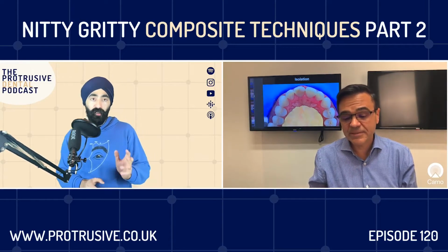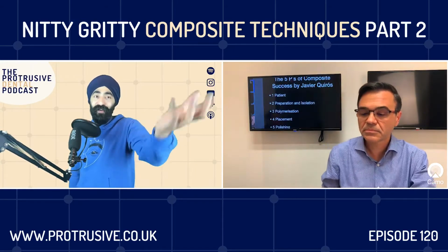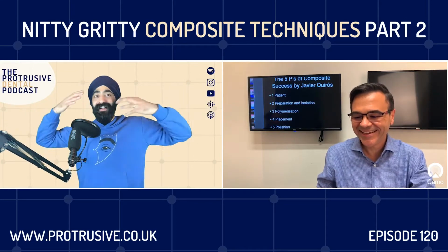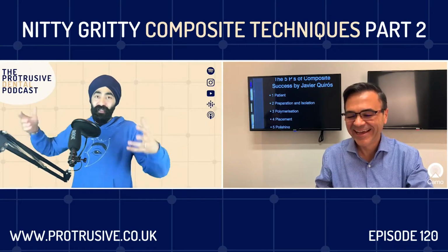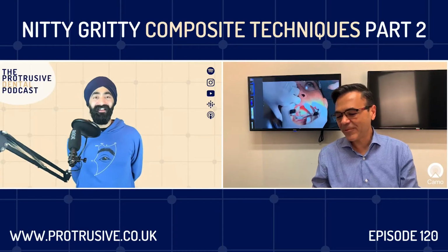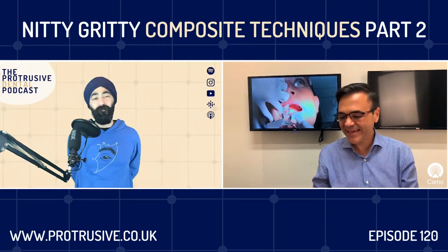So 100% agree. And I just want to comment on one thing I just saw in your video, which I don't do, but I'm totally going to do now, is that random tissue that you put underneath the rubber dam. Yes. I mean, I don't know why I don't do that. This sounds like an obvious thing to do, but I'm going to start doing that. So is it just like a normal? It's a napkin. It's a tissue paper, Jazz. Yes. And you just cut one corner when it's folded, and then it becomes a big circle. Yeah. Yes. I love that.